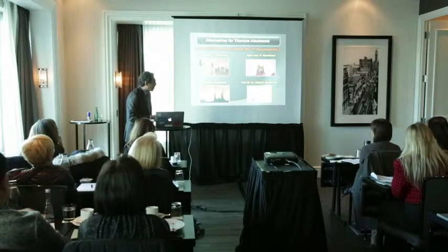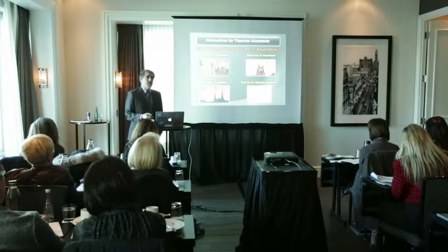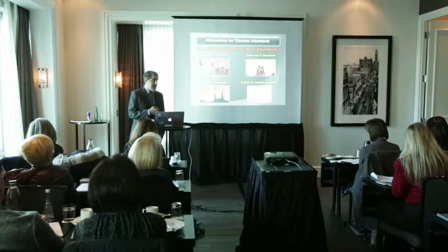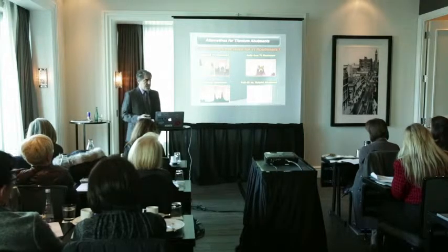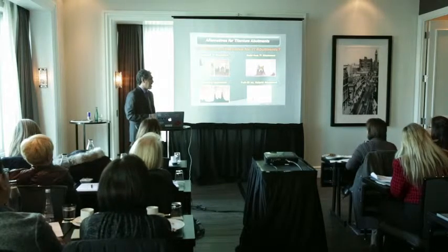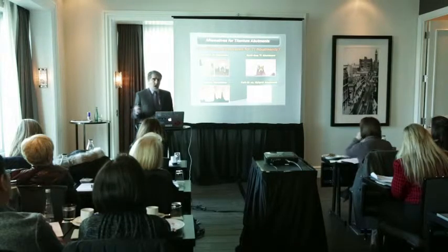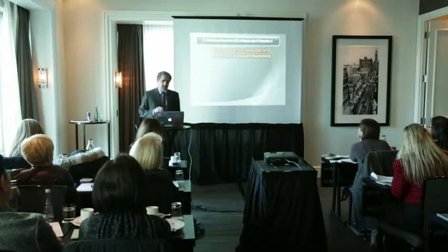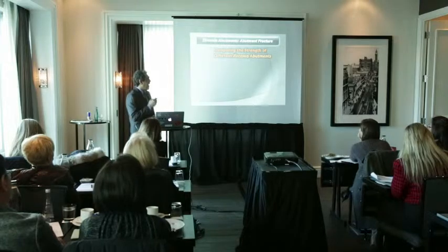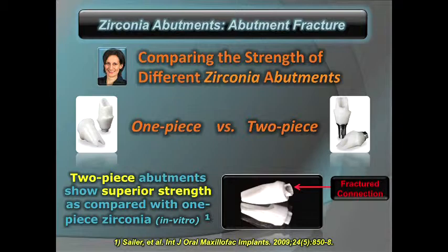The other option is zirconia abutment. Nowadays it's very common using zirconia. We're getting better and better with zirconia, and of course we're not going to have much problem with zirconia. However, with zirconia there are a couple of different options that we have to pay attention to. We have to make sure that we are using the zirconia abutments properly, and to know which type of zirconia abutment would be the best option.